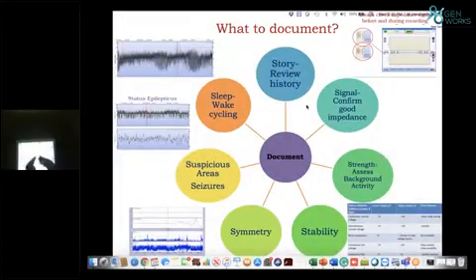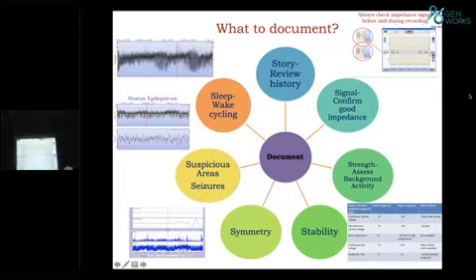So yesterday we discussed how to detect the seizure. Only thing is, just like a namaskara, means like this. Always seizure will be like this. Please, I am showing you people. Suppose if it is an arc, beautiful, thank you. If it is an arch like this, that means it is an artifact. Suppose if it is like this, a strike, like a namaskara, like a peak wave, if it is like that, it is a seizure. Then come to the symmetry.